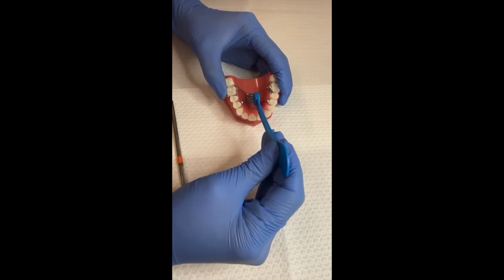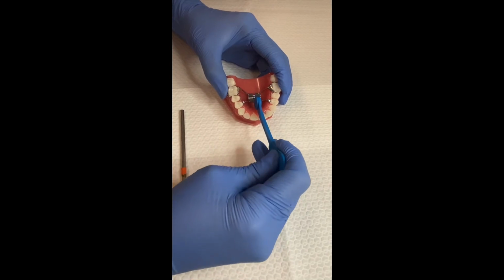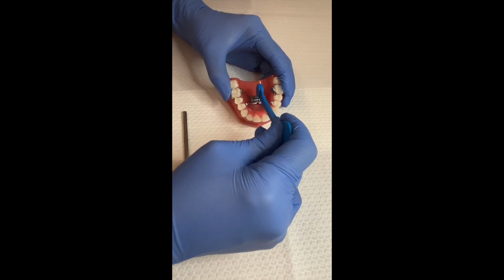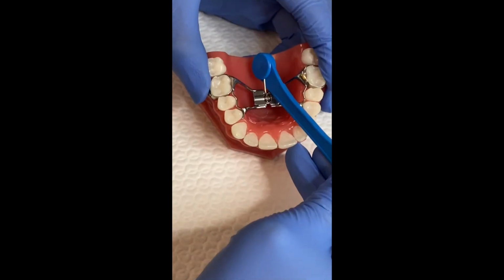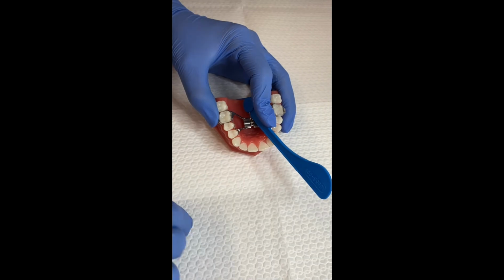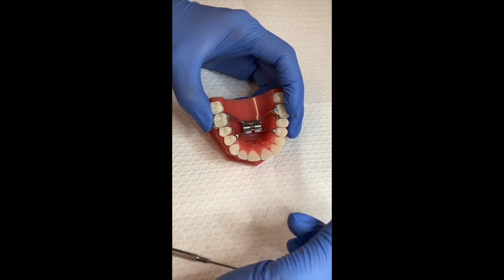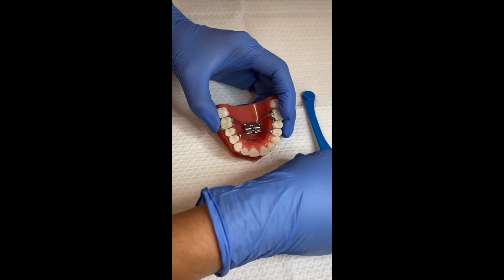When you're ready to turn, push the key towards the back of the mouth, holding it upright. You need to push all the way until you see the next hole appearing, and the key cannot go any further. That would be 1 complete turn. Pause for a moment and then gently remove the key. Make sure to gently move it straight down without pulling it forward again, as this would reverse part of the turn and could hide the next hole.